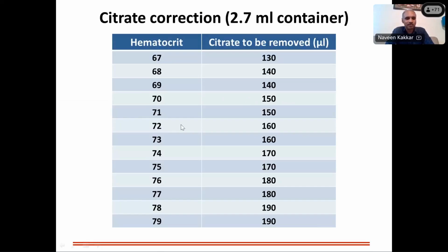So what have we done? We've reduced the amount of anticoagulant to compensate for the lesser amount of plasma in this patient. So am I clear, Preeti and others? Yes, sir. Okay.